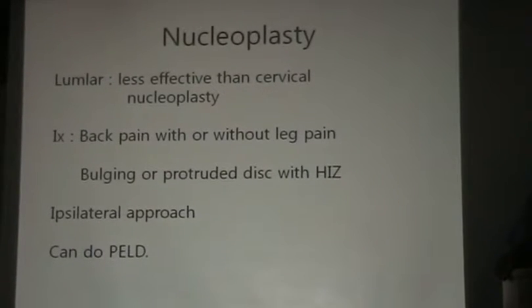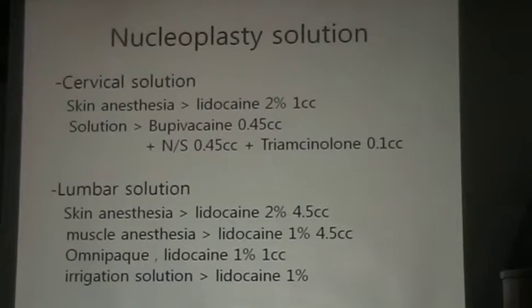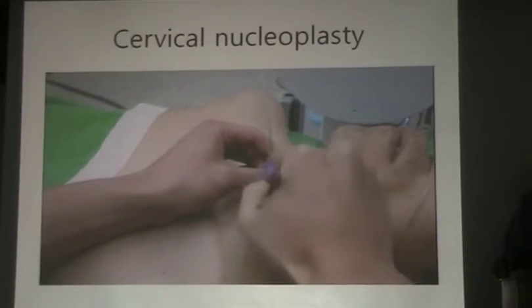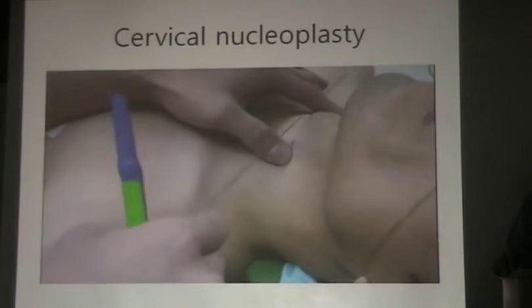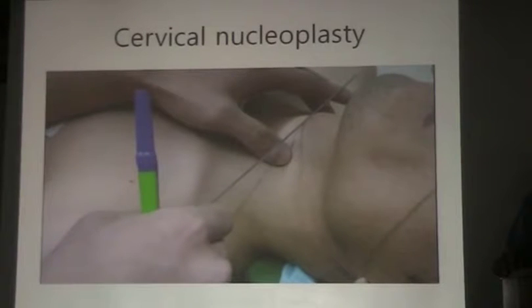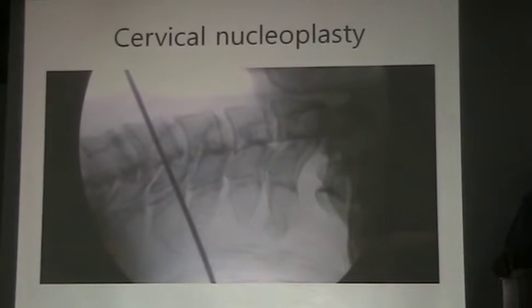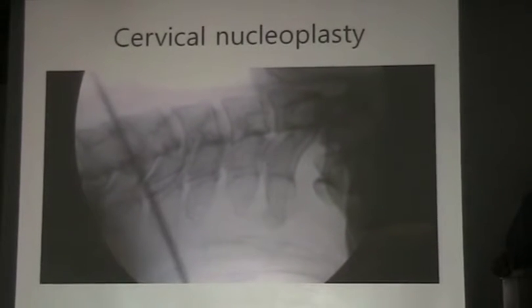And if you can do nucleoplasty in lumbar and cervical, you can do percutaneous endoscopic lumbar discectomy also. Nucleoplasty solution in the cocktail like this. I will give you by USB, so don't worry. And my assistant always prepares and checks the level of the operation field. C5-6.